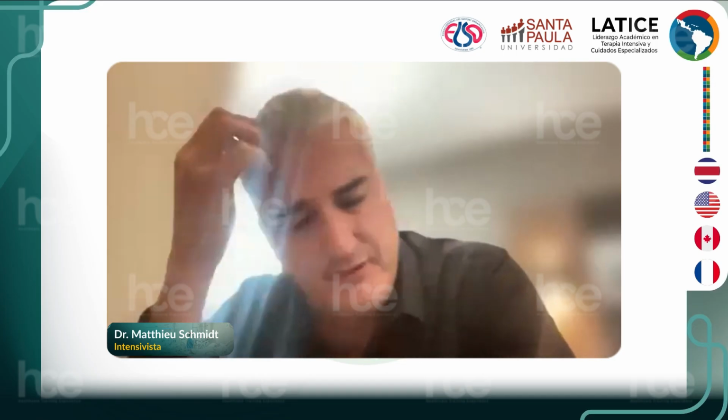Maybe a subpopulation where it could be useful is patients with sickle cell disease. There are lots of patients with this disease in France. When you usually have pulmonary hypertension, RV dysfunction, and an acute chest syndrome, in that subpopulation it may be a niche to use this technique as a first strategy. But again, with very limited evidence.